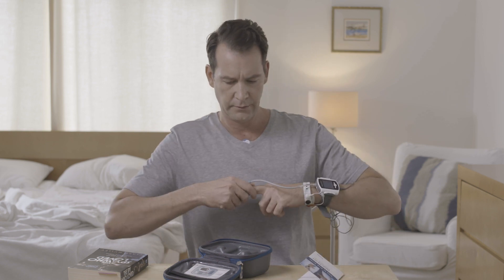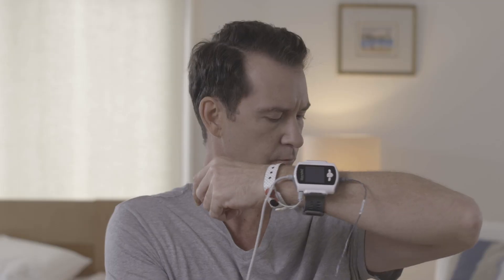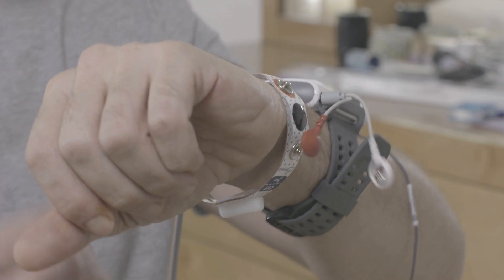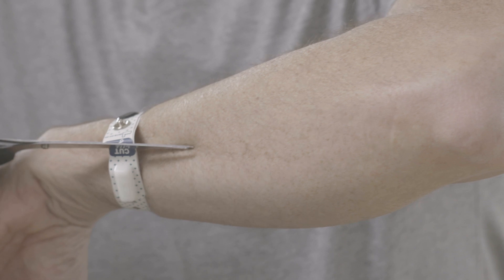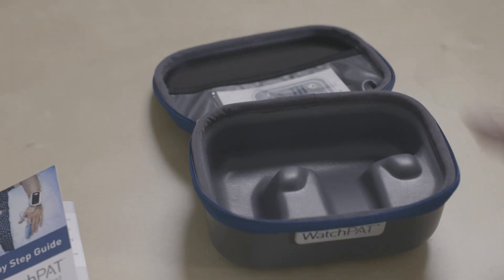Remove the probe from your finger. Remove the snoring and body position sensor. Disconnect the bracelet from the cables connected to the WatchPad and remove the device from your wrist. Please note: WatchPad cannot be turned off. Cut the bracelet along the dotted line using small scissors and insert it into the WatchPad case along with the other parts.